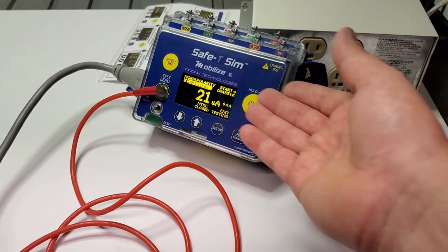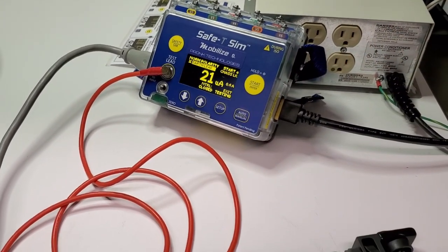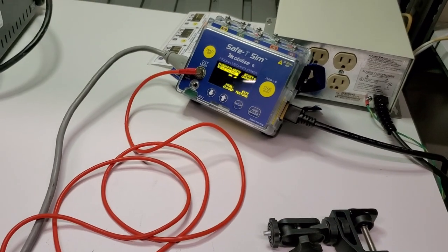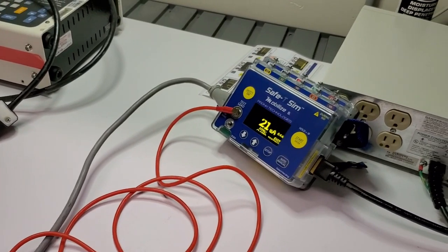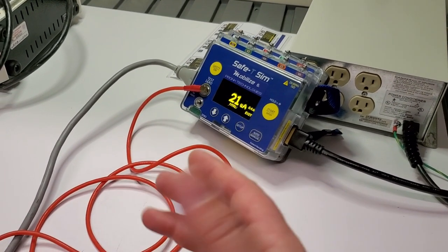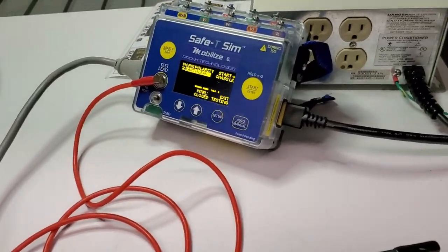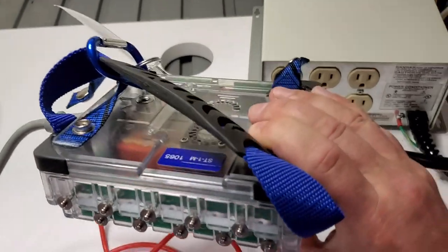Notice it went from ground immediately into earth leakage, and I just continue through the rest of my tests manually, step by step. I like how it auto-scrolls from the ground straight into chassis leakage and earth leakage. That's pretty much it — it's a well-rounded, lightweight electrical safety analyzer.